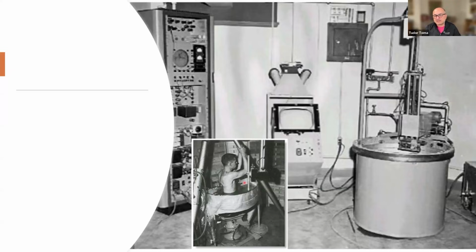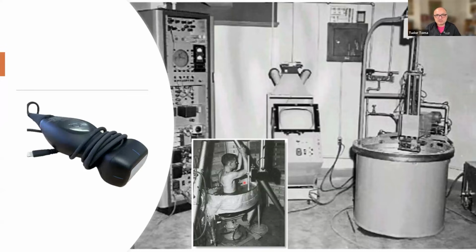However, we all know that the technique has progressed, and the ultrasound system that I'm using mostly in the clinic, on the ward round, and also with me in the bronchoscopy room is this device, which is a pocket ultrasound.